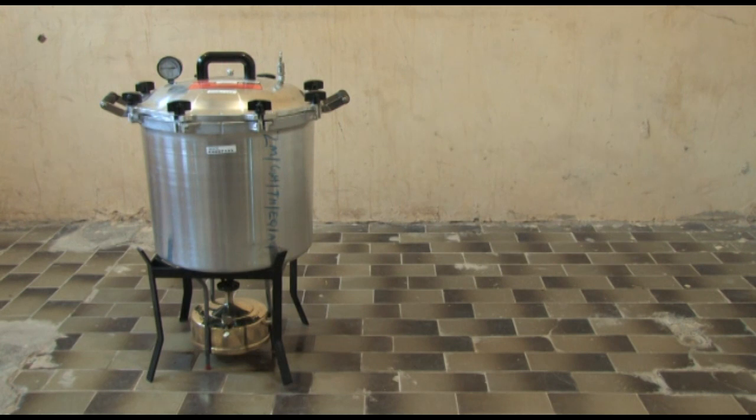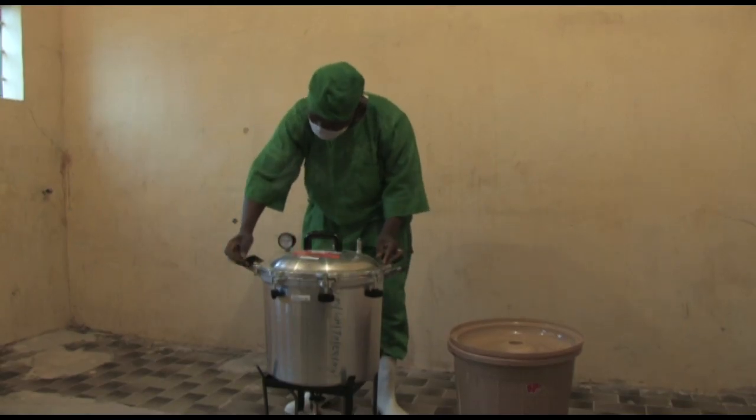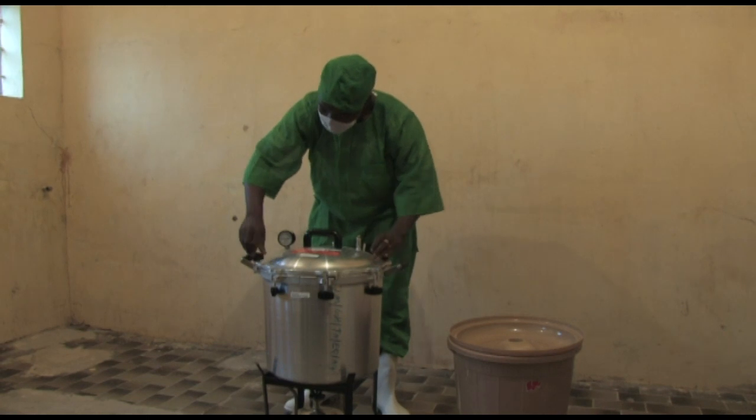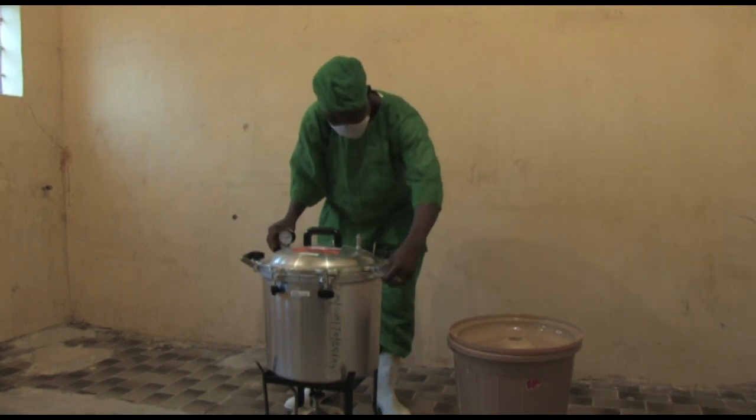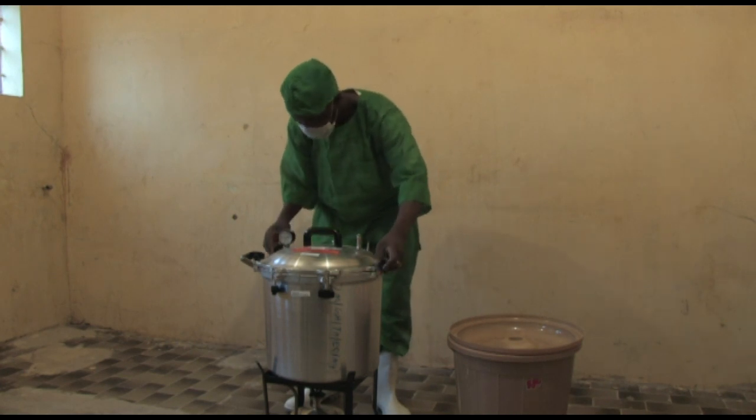As with any piece of equipment, it's important that the people using it understand how to get the best out of it and how to carry out simple day-to-day maintenance. It's no different with a portable autoclave.